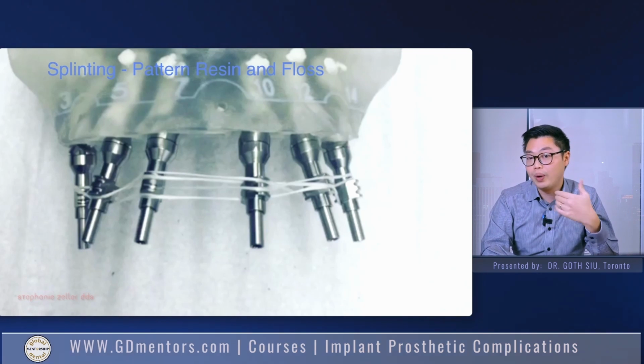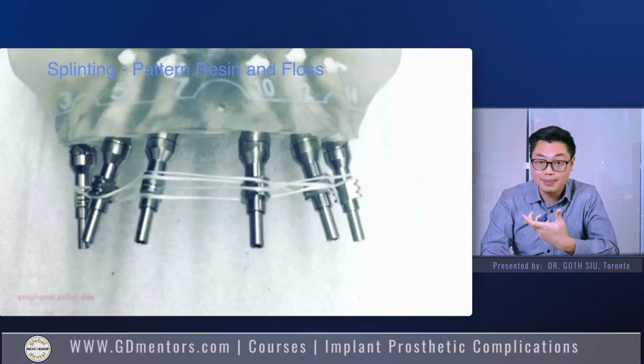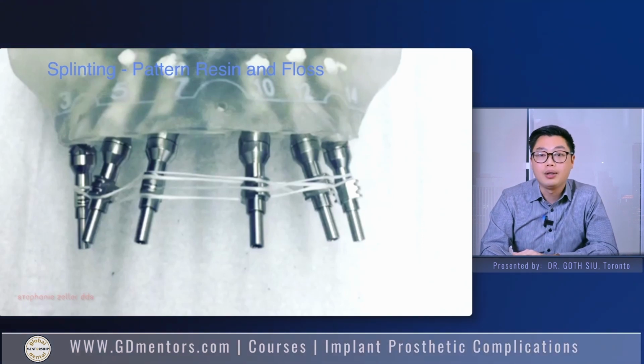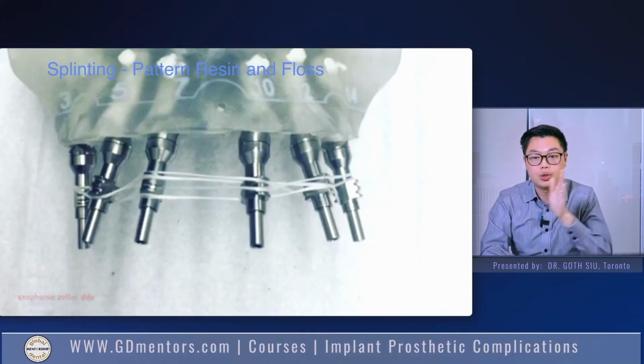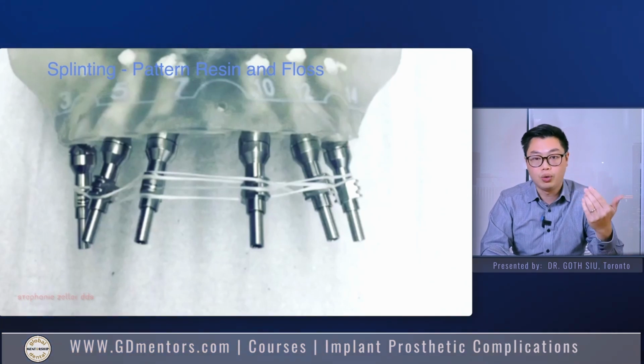You generally want to wait like a good 10 minutes for things to set and to shrink, because these materials will shrink, and then go back in and section them to relieve the stresses from the shrinkage, and then rejoin them. Therefore the shrinkage is now a small percentage of those cuts. So overall much less shrinkage.